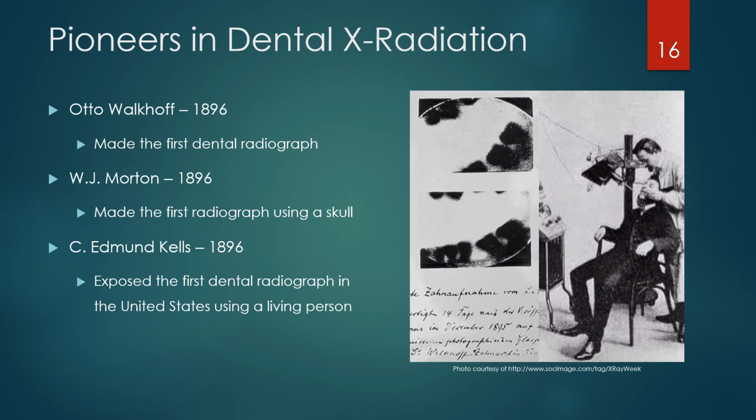So then we have Otto Walkhoff in 1896, and he actually uses the X-ray to make the very first dental radiograph. Walkhoff produces this first dental radiograph by exposing his own mouth on a photographic plate for 25 minutes. Like, I don't know about you guys, but we would have a very hard time convincing patients to take radiographs if we were going to have to take 25 minutes every single one. I'm glad things have sped up a bit.